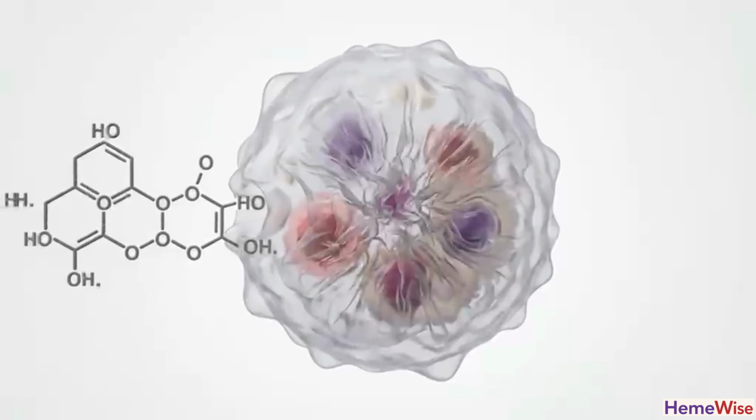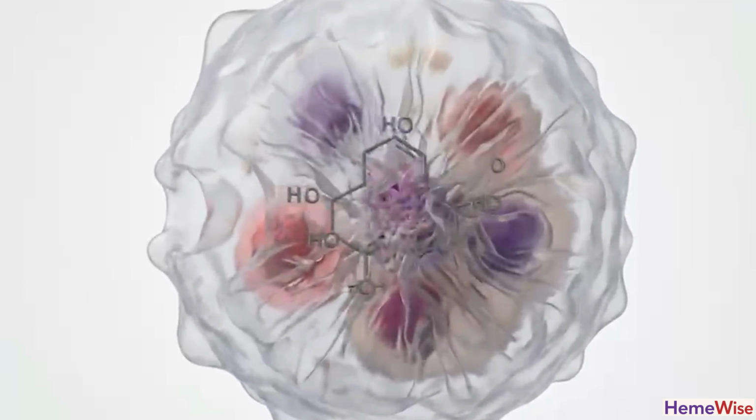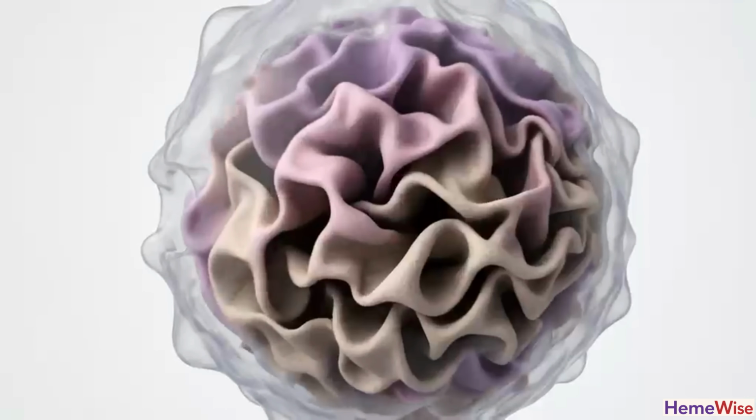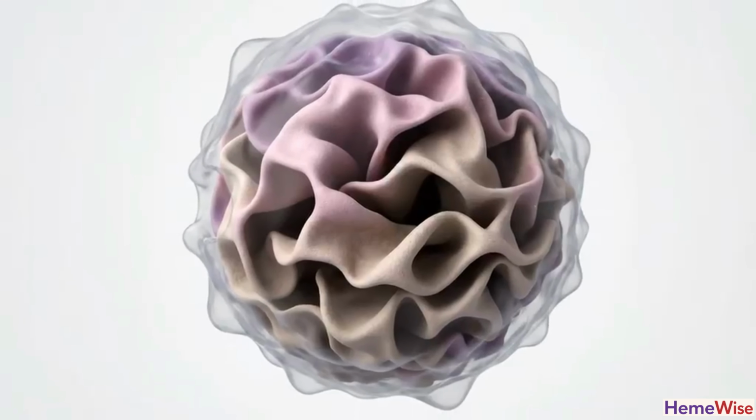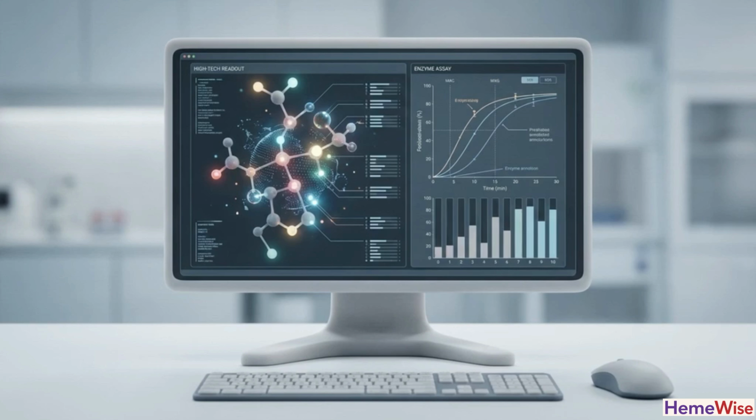This is a Gaucher cell, caused by a GBA1 deficiency. As glucosylceramide accumulates, the macrophage's cytoplasm develops a fibrillary, crumpled tissue paper appearance. This can be mimicked by the pseudo-Gaucher cell, which appears in high turnover states like CML. Because of this morphological similarity, visual findings must be confirmed by enzyme assays or molecular testing.